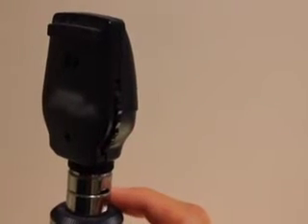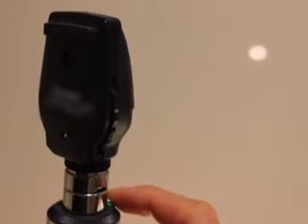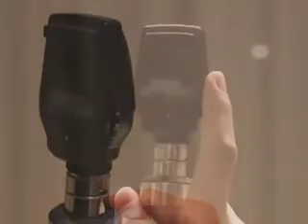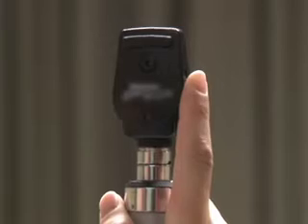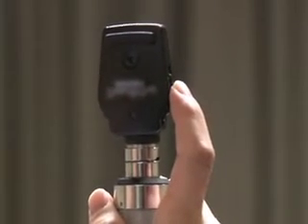It is best to use the ophthalmoscope at 80 to 90% brightness, with the small or medium circle, to reduce the patient's pupillary constriction. The ophthalmoscope contains a range of lenses with positive and negative diopters that compensate for refractive error in the examiner and the patient.